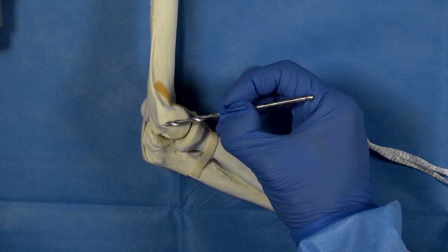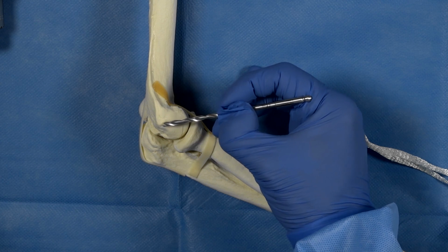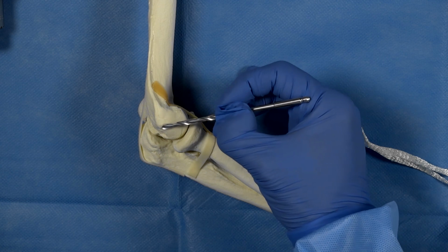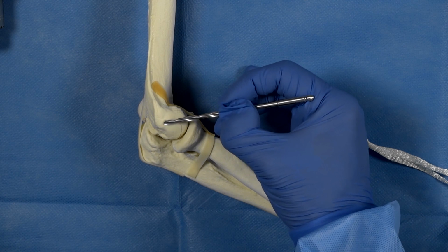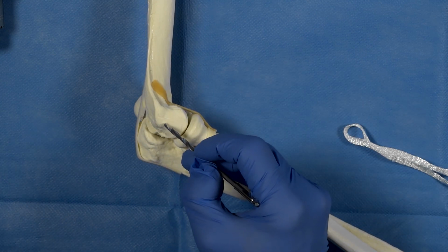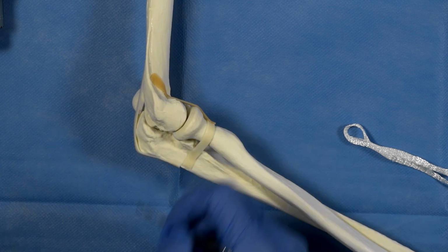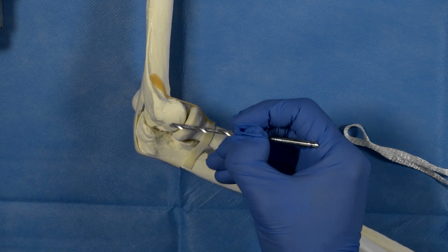And in fact, if you palpate in the patient, you'll actually feel that just as on the medial side they have a protuberance, the medial epicondyle, on the lateral condyle there is a protuberance, the lateral epicondyle, and the ligaments arise from the inferior surface and anterior surface of that protuberance. So when you palpate that, you know that your ligament and therefore your bone tunnel needs to arise from this position.